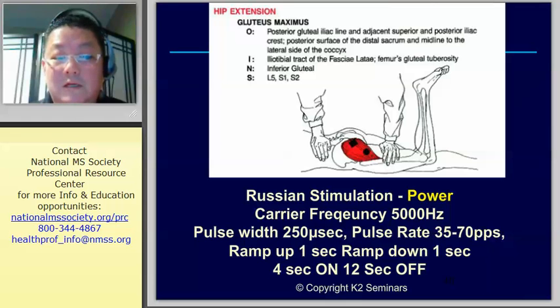So when we're dealing with gluteals, again, take a look at the circle versus a square, which will tell you exactly where your positive and negatives go. Remember, the circle represents the negative pole, and the square represents the positive pole, which is your red electrode. Making sure you have the electrodes in the right position will be essential to get the motor point, which is typically where the black electrode goes, to get the best contraction.